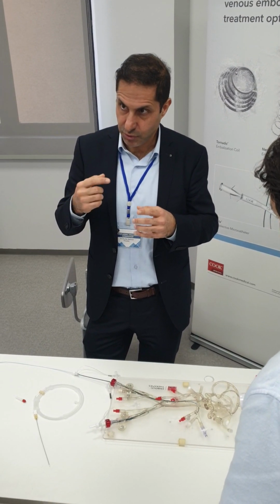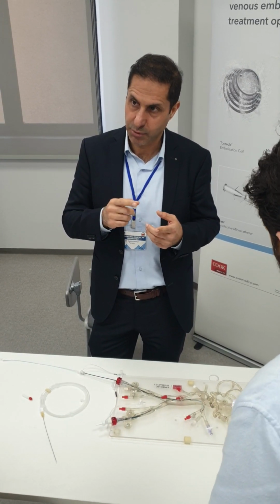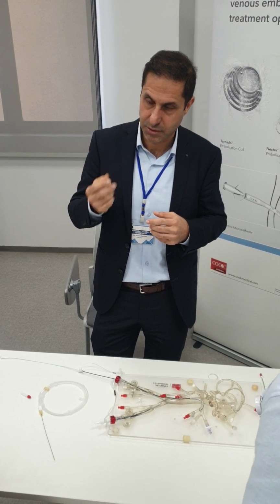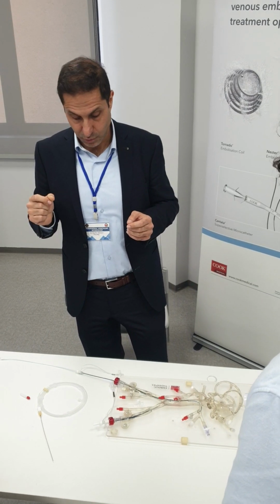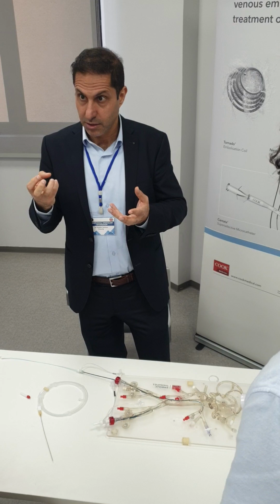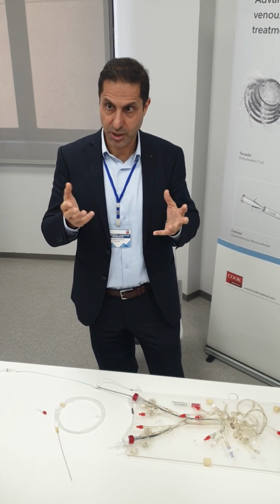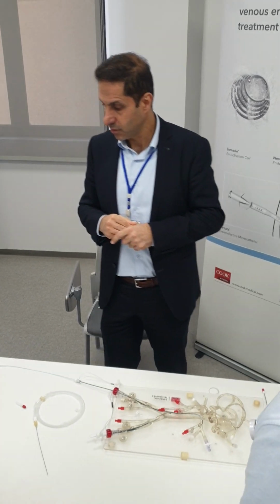The other coils used in cerebral interventions, they are not fibered, and this makes sense. We want to avoid thrombosis in these vessels, avoid complications like stroke. There are other coils, they can suck fluid and they will expand in size, hydrogel coils, different types of coils.